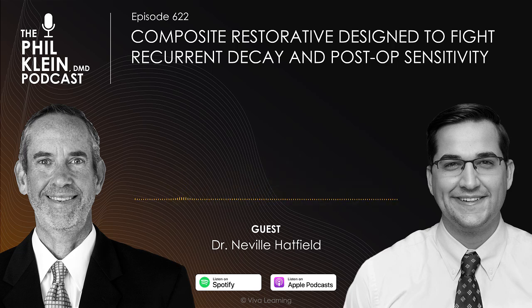So there's, let's say, a handful of companies that are really in the bioactivity space that have done really well in terms of adding bioactivity into their composite resins, turning them from a passive material in our mouth into one that's more of a symbiotic or active participant in the oral environment.